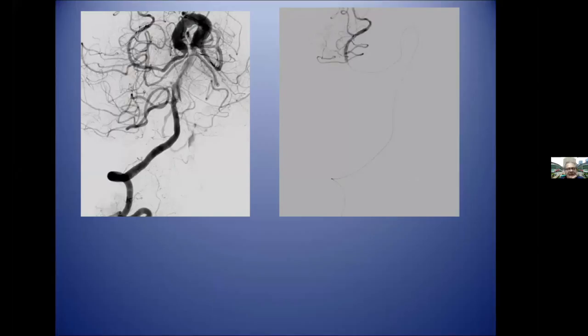Nice. Okay, whatever you are doing, it is a very challenging case, and desperate cases need desperate treatment. This is how it goes here. But I think maybe there are no PCOMs in this case. What we have introduced is the slow closing clip somewhere here.